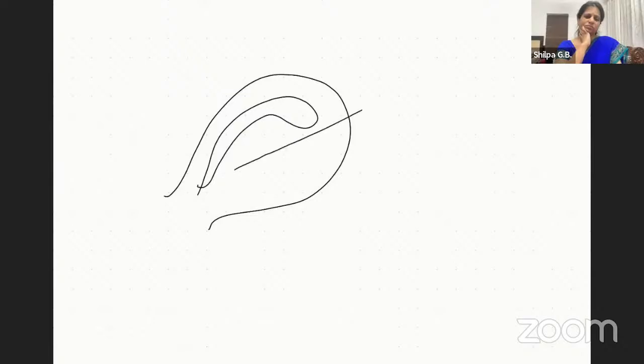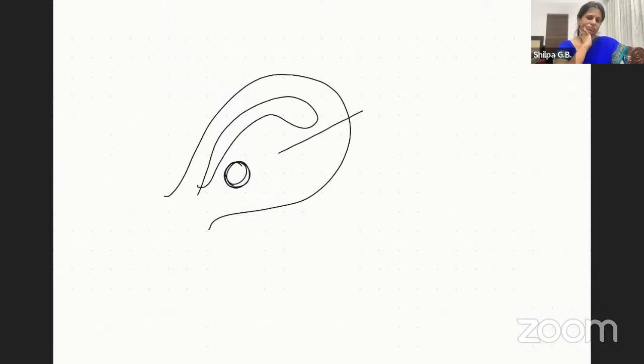Let's assume you have placed your probe here, madam. So the primary ablation has occurred here. Then you will withdraw the probe a little. Let's say you withdraw the probe, you came here, madam. And then the ablation radius will be like this.